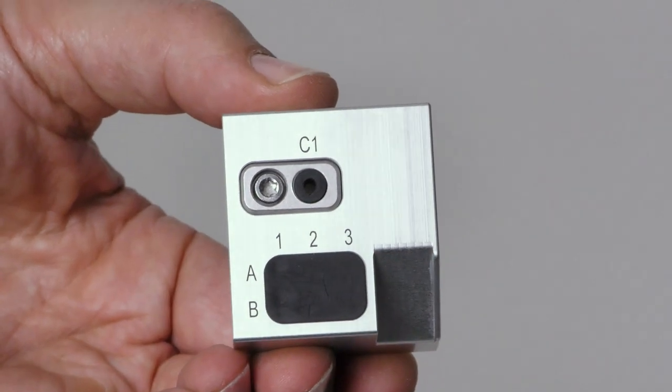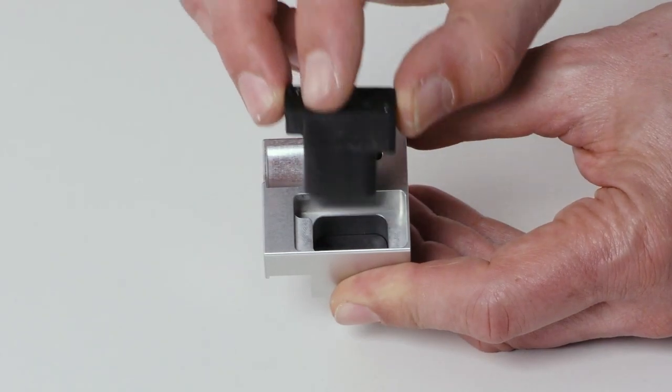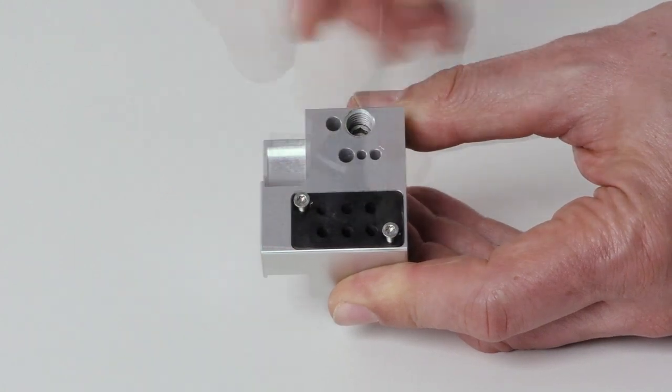If this is not the case, correct the position of the insert. Insert the holder for the tool magazine insert into the tool magazine. Insert the two screws into the screw holes in the holder and tighten them.